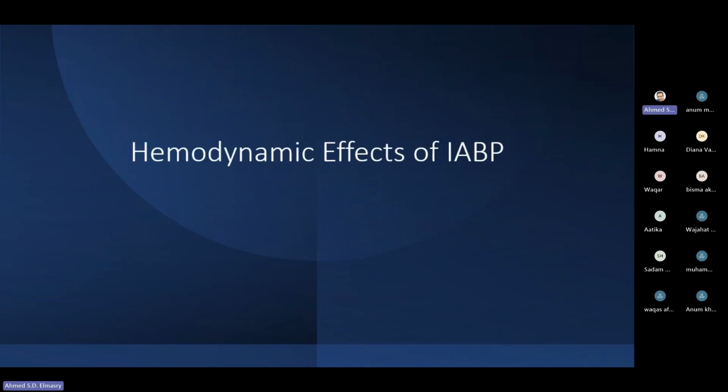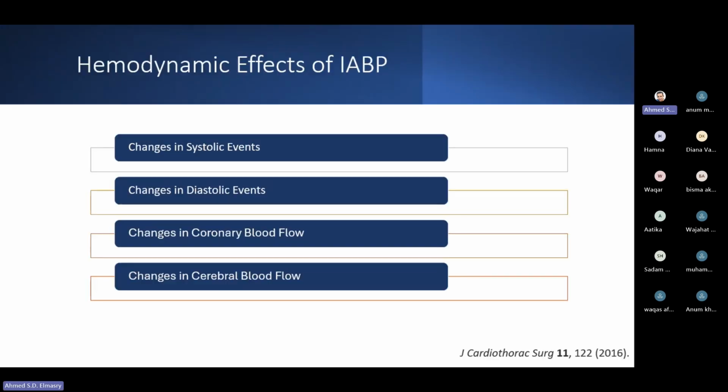Regarding the hemodynamic effect of the intra-aortic balloon, you will have many changes that happen with it: changes in the systolic events, in the diastole, changes with the coronary blood flow, and changes in the cerebral perfusion.